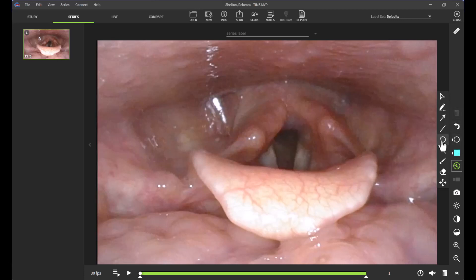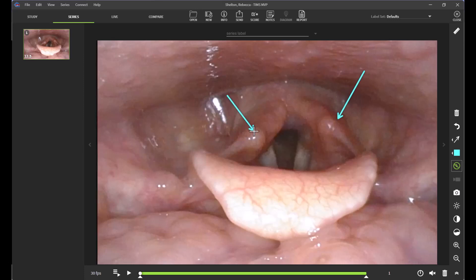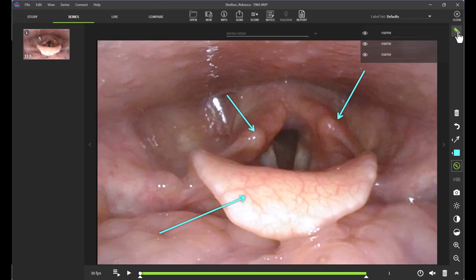To add in my arrow, I'm going to select it as shown and point out a couple of anatomical sites as indicated. To label these telestrations, I'm going to click on my measurement tool here, and you can see that I now have three opportunities to label in correspondence to the telestrations.